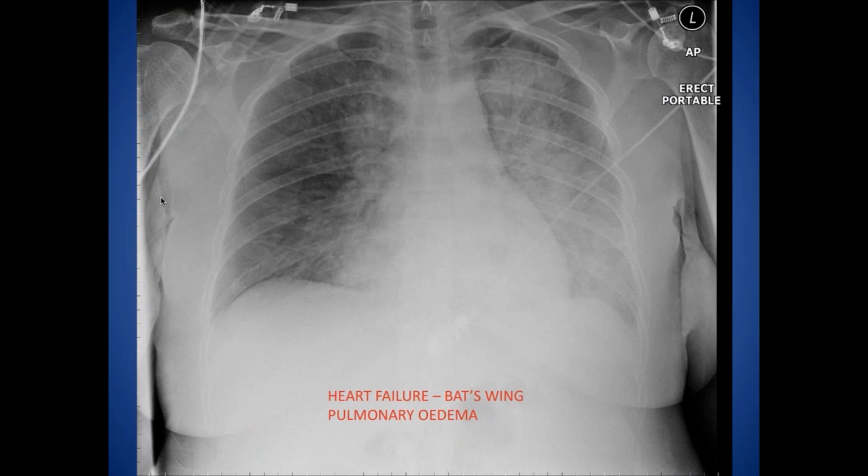The thing that demarcates pulmonary edema from ARDS is usually other features of pulmonary edema, such as upper lobe blood diversion, the perihilar central nature of the edema. The patient may be fluid overloaded or may have cardiac disease or an enlarged heart, and there may be associated pleural effusions. Whereas ARDS tends to be a bit more general in its distribution.